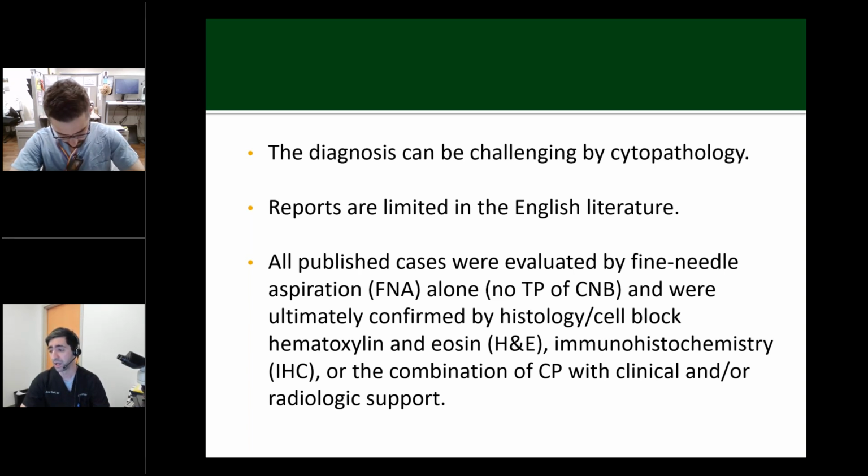These cases ultimately required confirmation from different aspects such as histology, cell block, H&E staining, as well as other IHC markers that we use, and the combination of cytopathology with clinical and radiology support as well.